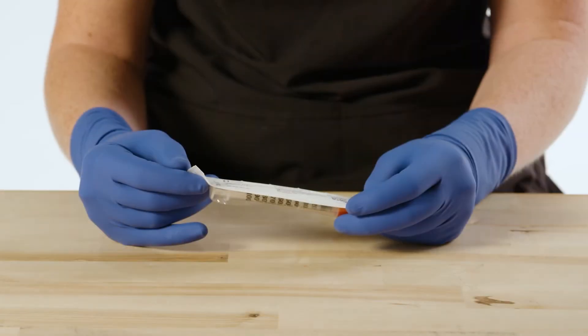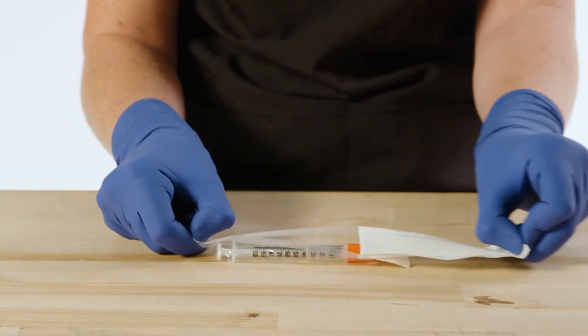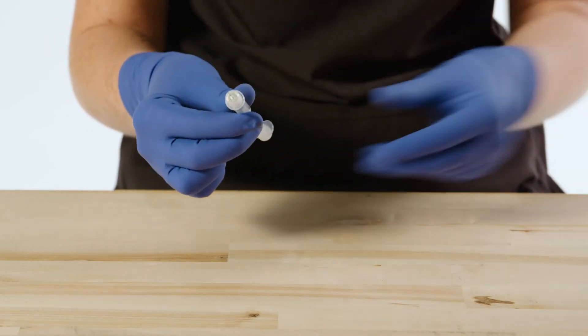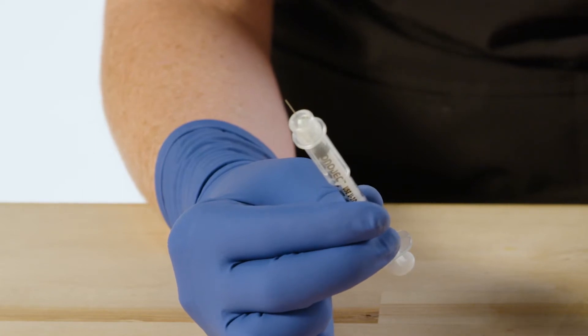To open the Monoject safety insulin or tuberculin syringe, hold the plastic tab and carefully peel back the paper tab until the safety syringe is fully revealed. Remove the syringe and discard the colored cap. Note that it is not necessary to replace the cap with Monoject safety insulin and tuberculin syringes.